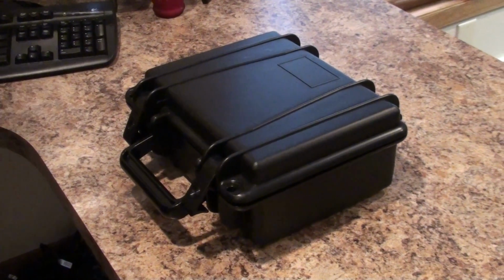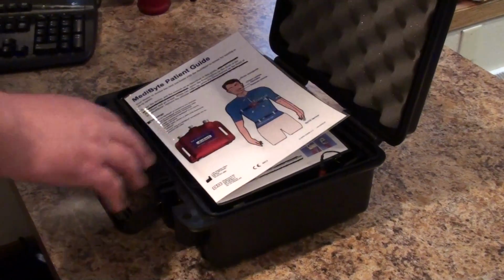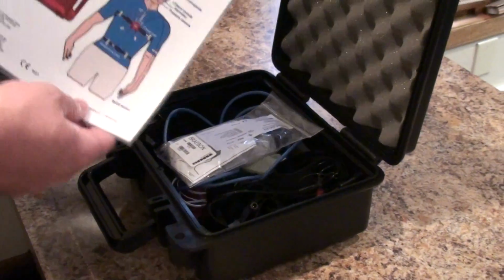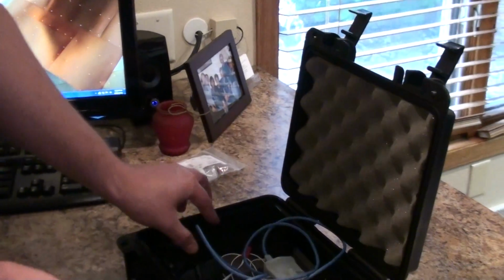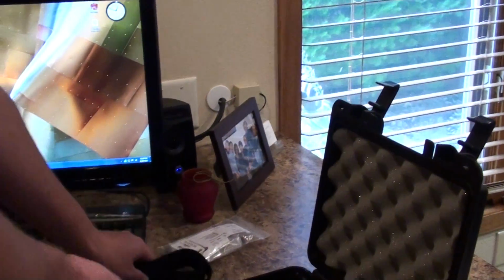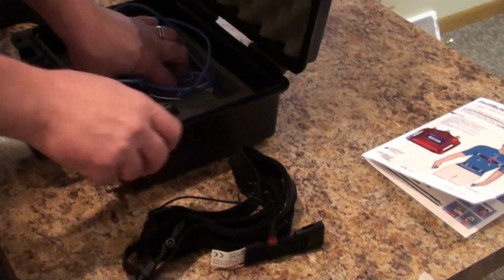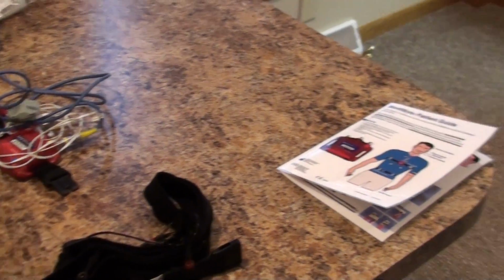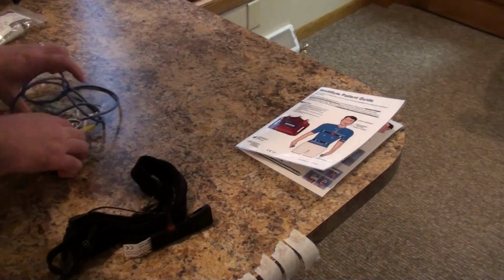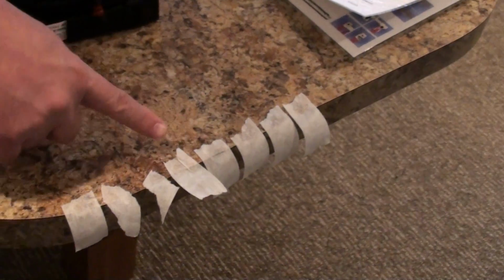This is a reference video for hooking up the MediByte sleep apnea recorder. You will want to start by laying out all of the parts to the MediByte machine in front of you. We have also enclosed a MediByte patient guide for your reference. A helpful tip: pre-cut 8 pieces of medical tape and have them lying next to you also.